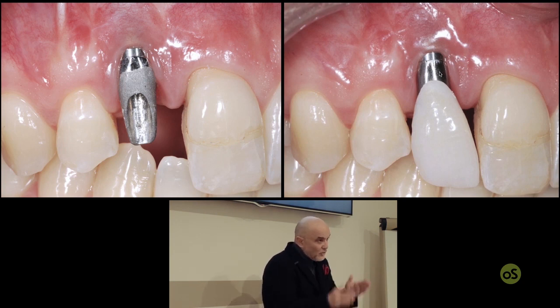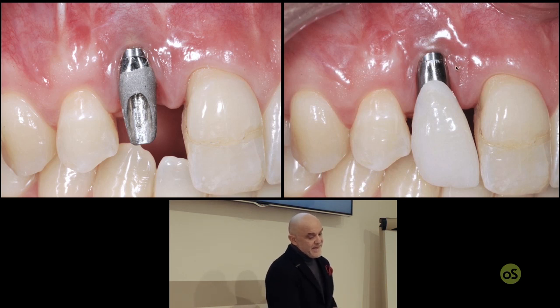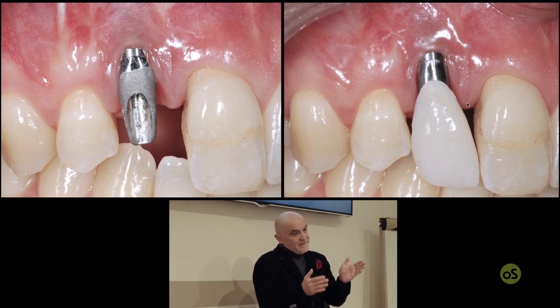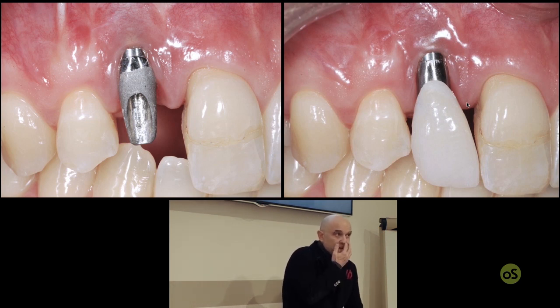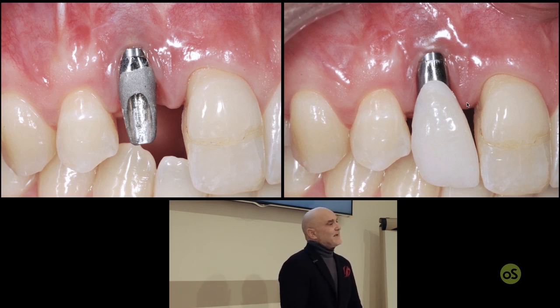So the more narrow, the more thin the abutment, the more short the temporary crown, the more space is left available for the papilla to fill and to become larger, thicker, mesiodistally, buccolingually. So this papilla is now really wider and thicker and can be used towards the palatal aspect.